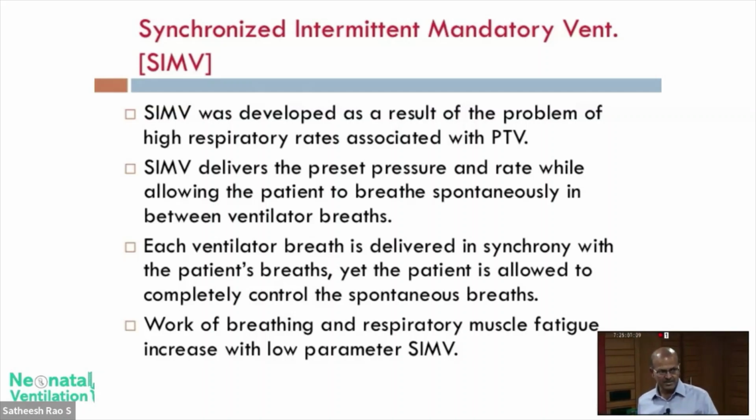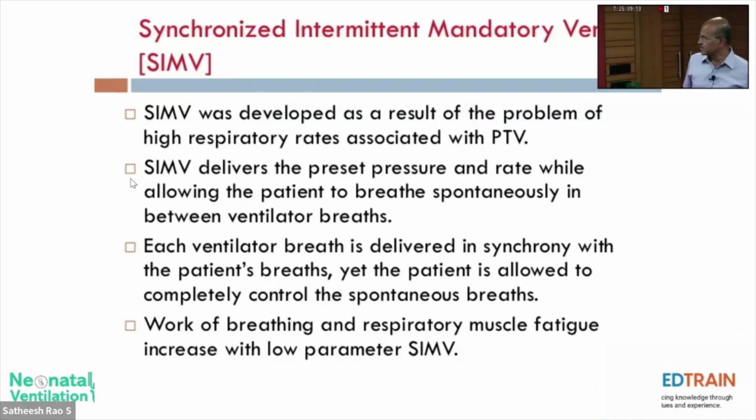We will discuss PS next, but in the non-PS modes, it only supports the baby's effort to a limited level. It doesn't support every breath. Each ventilator breath is delivered in synchrony with the patient's breath. So it has a set time gap. Within this time, if it picks up the baby's breath, it gives. If the baby doesn't breathe in that, say, 100 milliseconds, you will get a slightly longer pause and the ventilator will give the breath at that time.